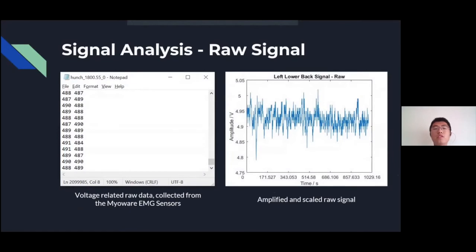Here is the raw signal. The left one is the original raw signal, which is voltage related and it's collected from the Myoware EMG sensors. And right side is the amplitude and the scaled raw signal. The right side diagram is plotted out from the left side original signal data.